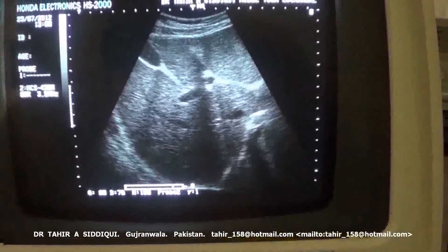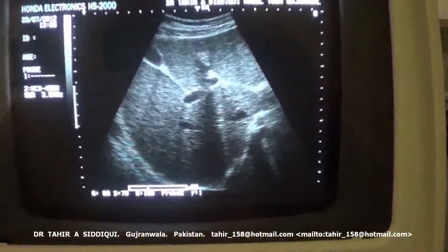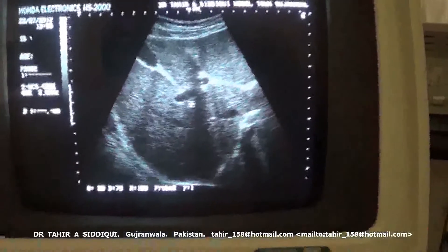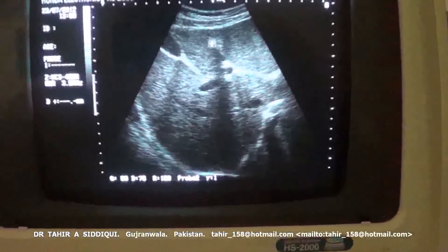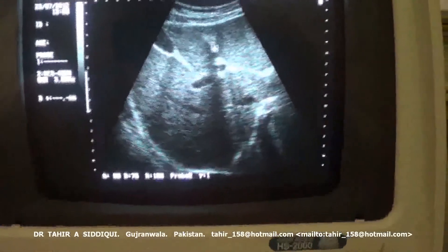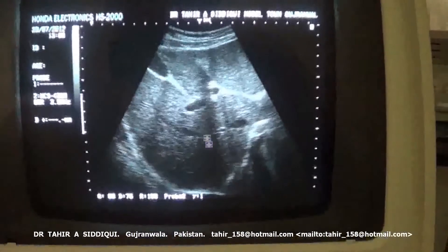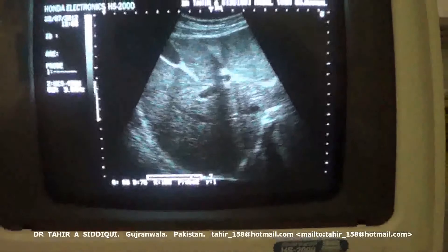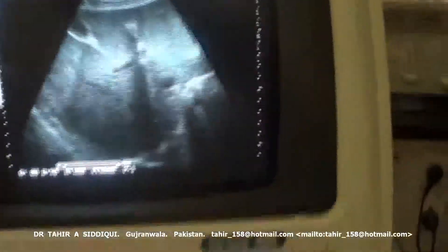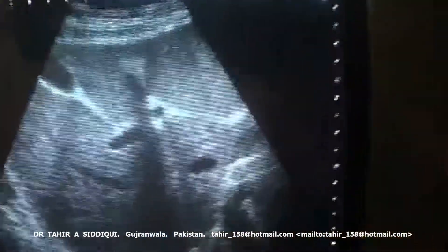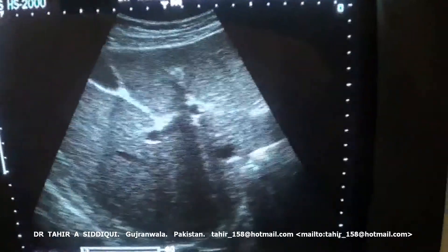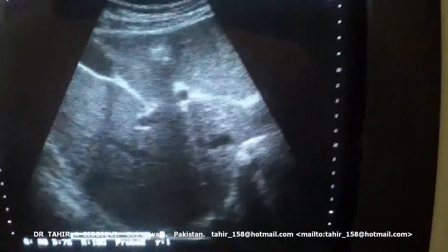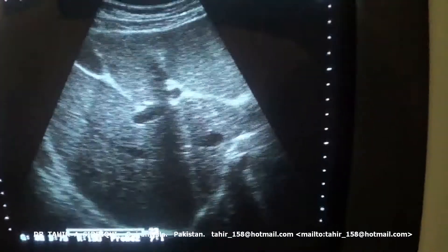If you see that the ligamentum teres is a triangular-shaped structure giving posterior shadow — here, this is a triangular-shaped area in transverse section giving this posterior shadow black. I think you will remember this. Thank you.